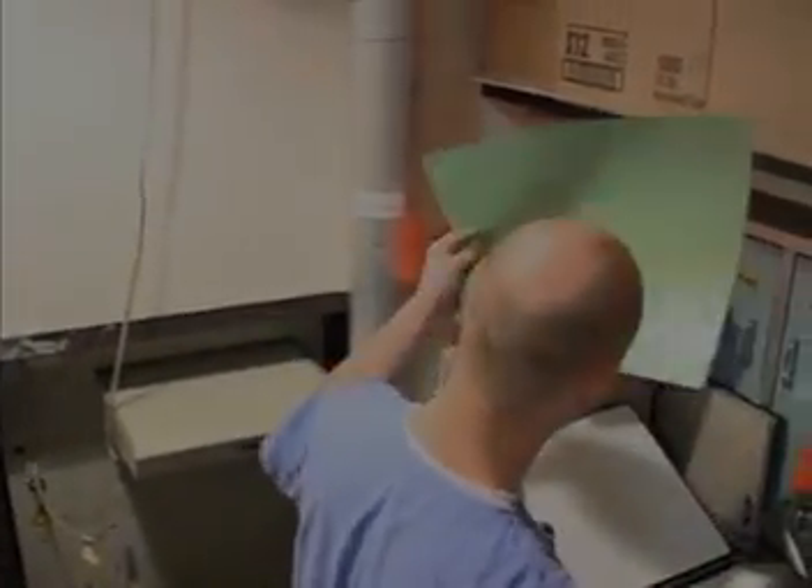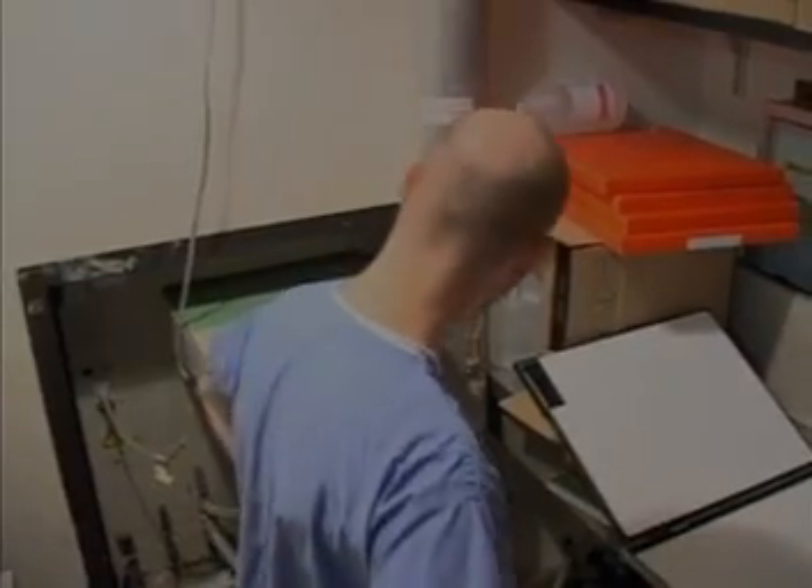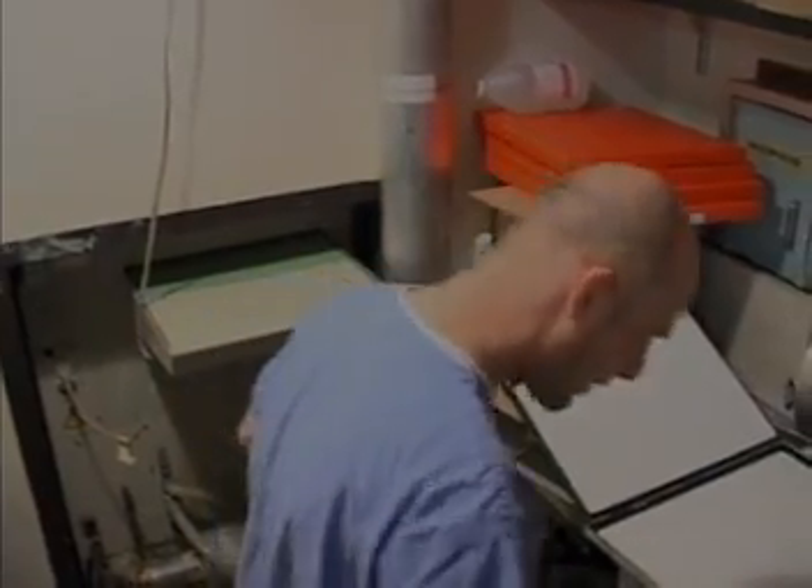Okay. I know this patient's been waiting. I don't like to see him wait, but I've got to click this open here, take the film out, put it in there, and wait. You've got to wait — no way around it.